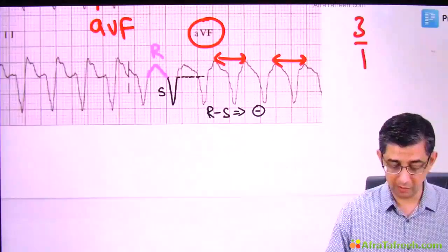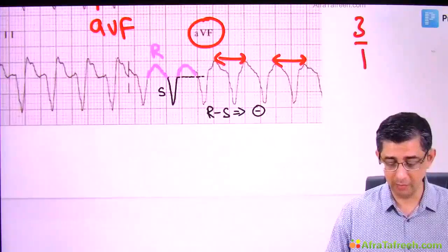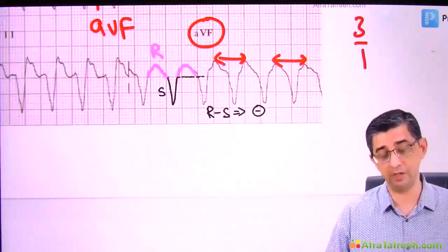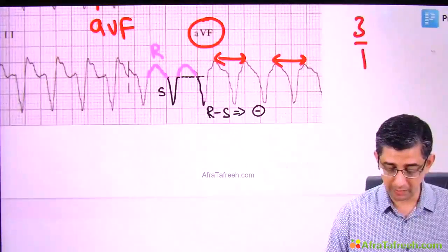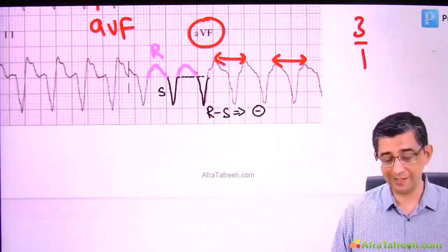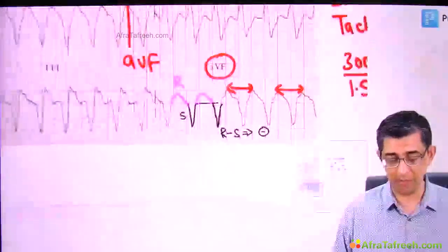The R wave, which is a positive wave, is slurred because of intermyocyte conduction, which you will be more comfortable with in the subsequent part of the discussion when I talk about VT. But at this junction, you can very well notice that as compared to the baseline, the depth of the S is much more as compared to that of R. That is why I have put a negative vector here.